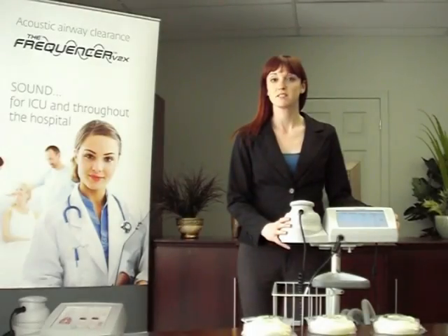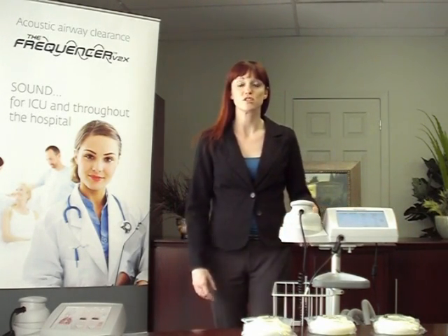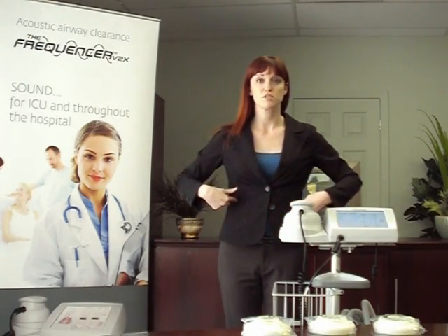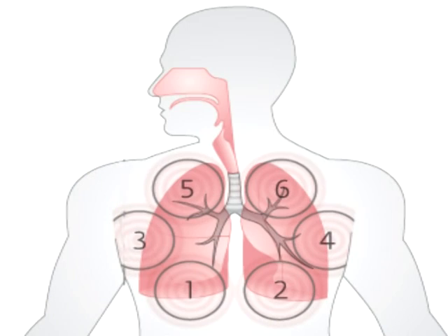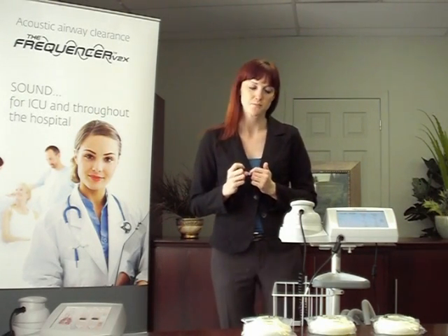Concerning the treatment, depending on patient needs, once to twice a day, 15 to 18 minutes total treatment time by using 6 different positions on the chest. So we have the sternum and the ribs here. So position number 1 would be 1, 2, 3-4 for men. For women, you would come under the arm, and 5-6. So that would cover the whole chest area. And we want to start from the bottom and work all the way up. The goal is to dislodge sputum, bring it in the upper airways, and make it more liquid.